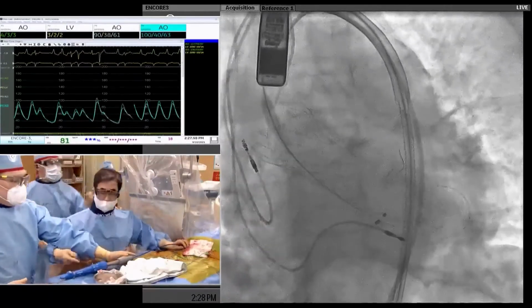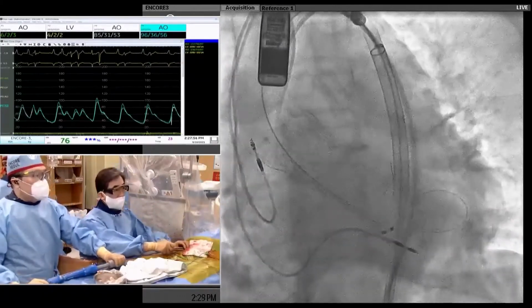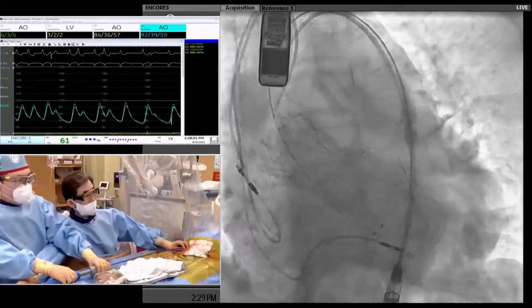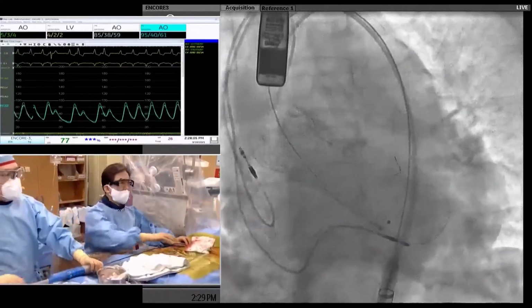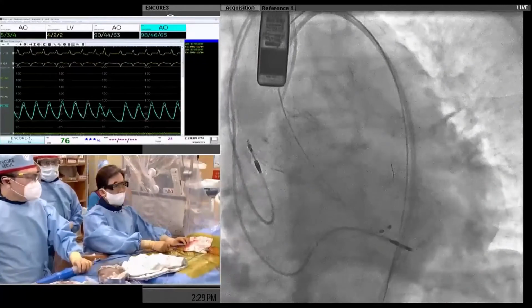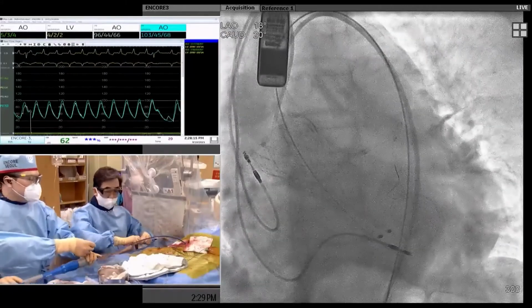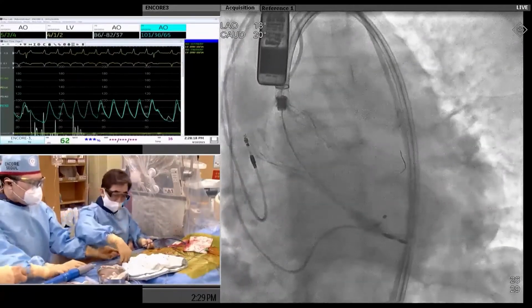Okay. Y stay 빼고. Y stay. 자, capture. In these images, even after the valve deployment, there is some clear distance between the left guiding catheter and the valve. It means that the possibility of the obstruction is very, very low.